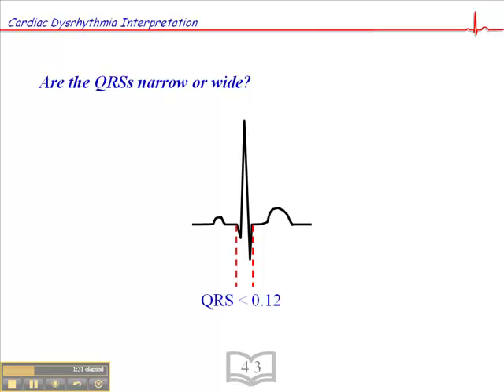A narrow QRS is less than 0.12 second, or less than three small squares. Some people teach that a narrow QRS is equal to or less than 0.12, and that is not correct. A narrow QRS is less than 0.12 second. If a QRS is 0.12 second or greater, it's considered wide.